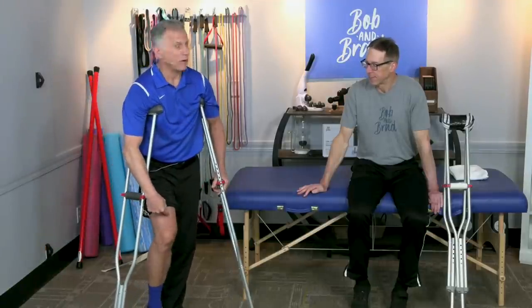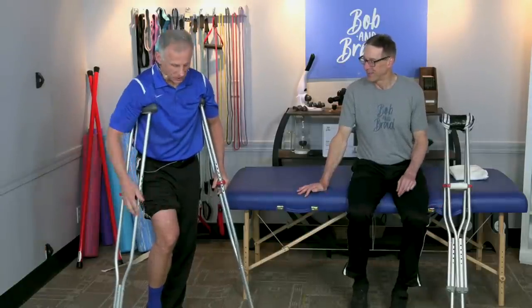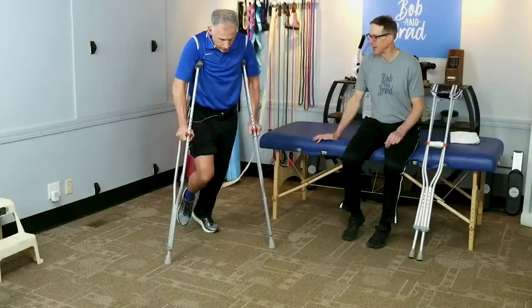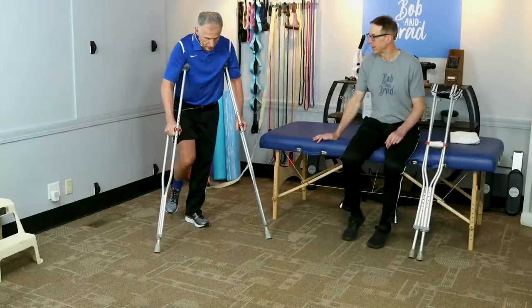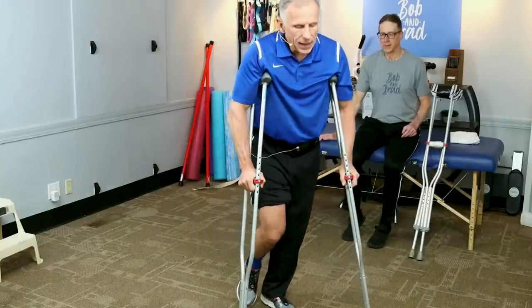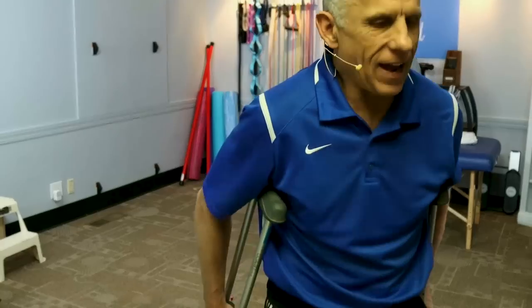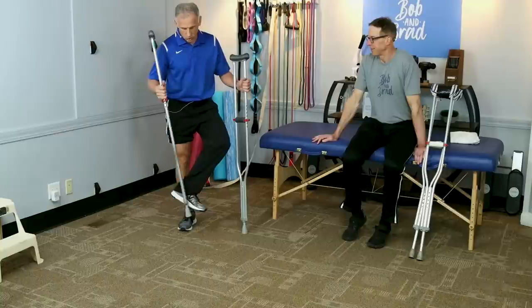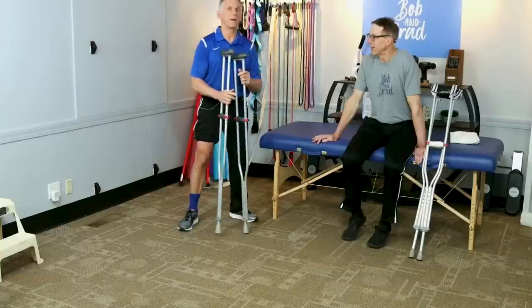For non-weight bearing: take both crutches forward with the injured leg up, then hop the good leg up to the crutches. It's safe and easy to negotiate that way. Younger people tend to get very good at it, then progress to the swing-through — but that requires good strength and good balance, because you could fall backwards. Make sure you're wearing shoes with grip; socks on a smooth floor, especially doing the swing-through, is a problem — you could break the other leg.